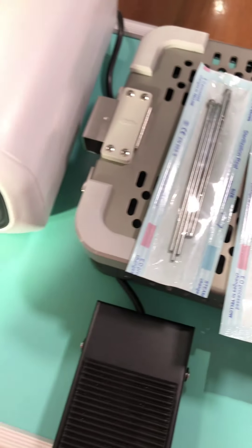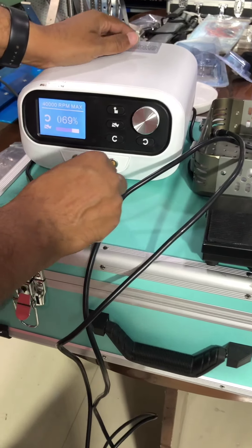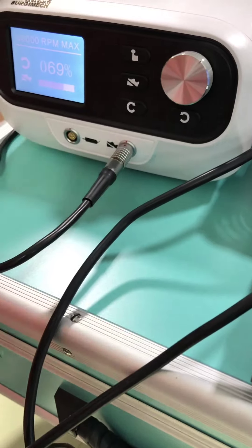It will come with the set. This is a foot switch. This is a motor connection.